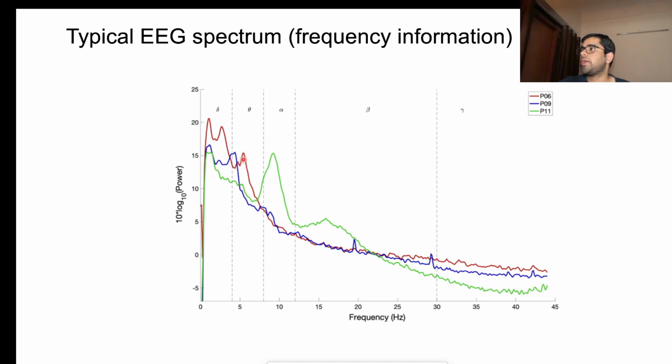You can do this in certain time periods also. We'll discuss the relation between time and frequency in more detail later. But if in your task they are trying to remember, you see a peak in theta, because theta is known in memory consolidation or registering certain memories.